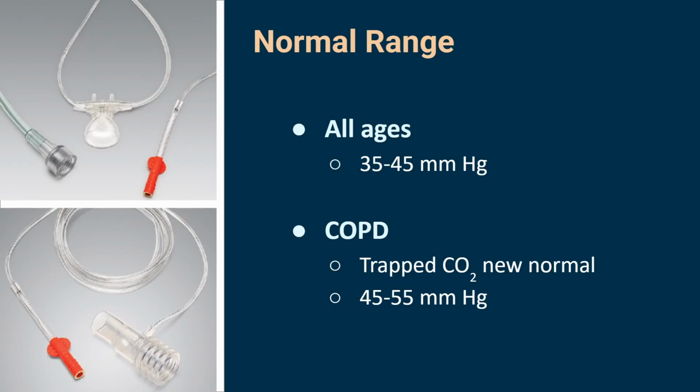Also, listen to me when I say that you need to be very careful about your scenarios. It happens to the AEMTs when you get capnography, and it happens to the medics when you get EKGs. Don't get so hyper-focused on this. I do think there's a ton of benefit from learning end tidal and what it means.